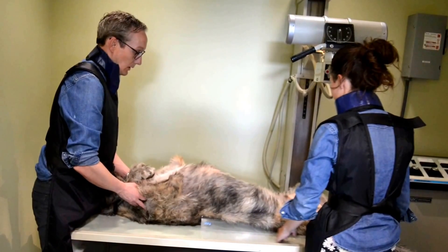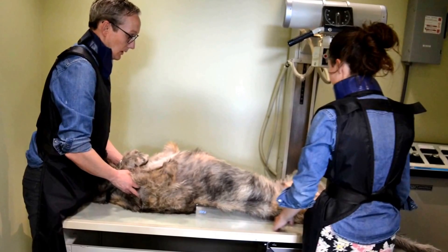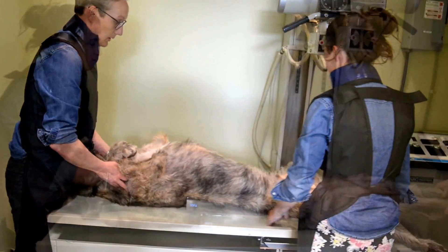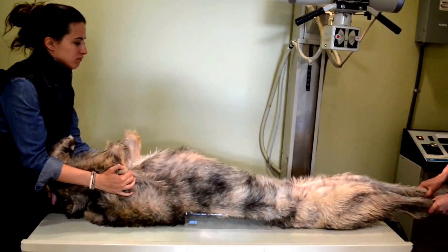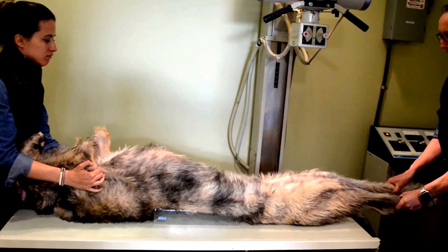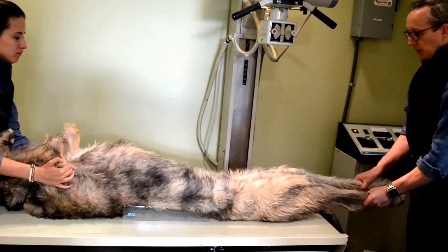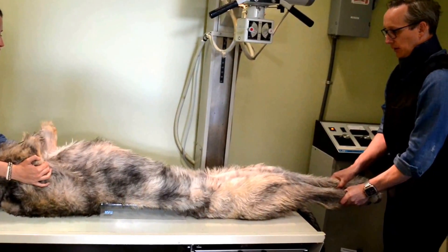The PennHip procedure involves three x-ray views. First is the hip extended or traditional OFA view. Some hip evaluations only look at this view, but the PennHip procedure involves two additional views to make an objective numerical evaluation of the hips, which we compare to other dogs of the same breed.